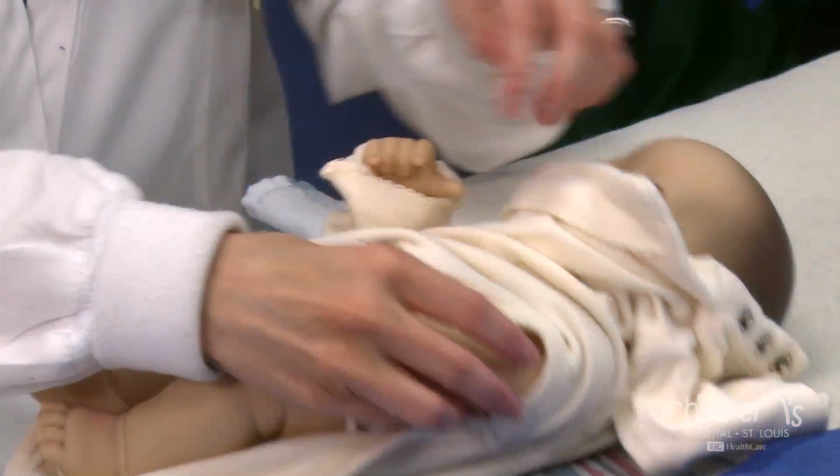You may notice sutures or stitches around your child's gastrostomy appliance. These are used to anchor the device to your child's skin. Later in your child's postoperative recovery, sutures around the appliance will be removed. This usually causes very little pain. Once your child is discharged from the hospital, you'll need to continue care at home. As with every medical device, there are some simple guidelines that should be followed in order for the gastrostomy appliance to continue to work properly.